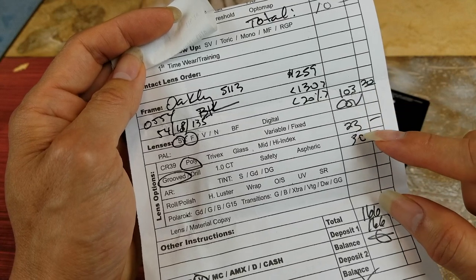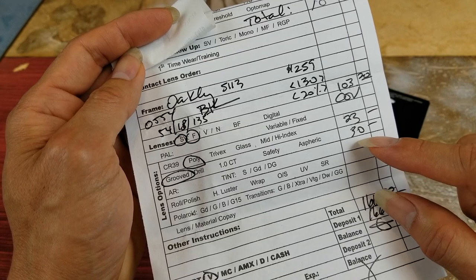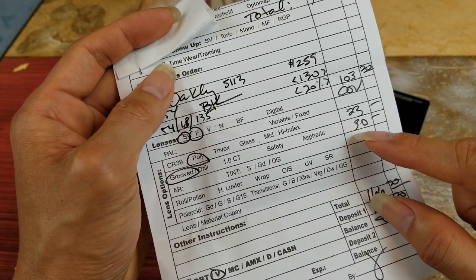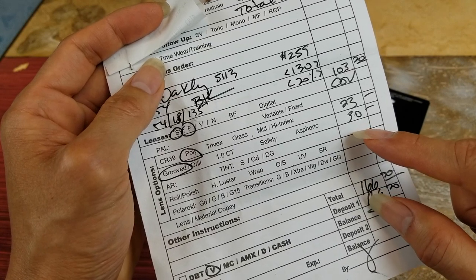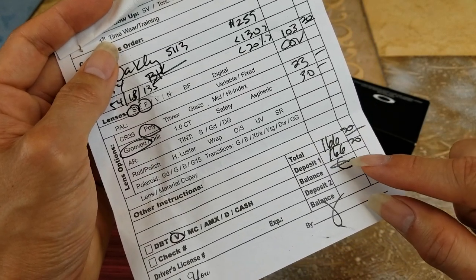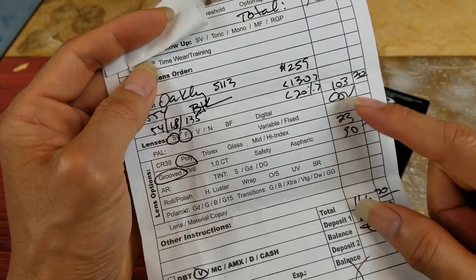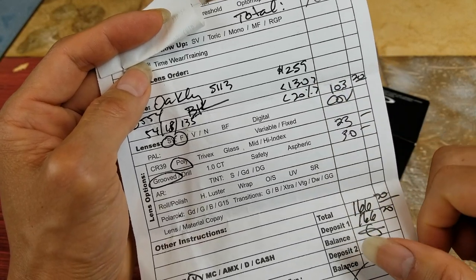There's also $23 for polycarbonate lens, and then $30 because this is a half frame, so they have to use a special plastic or some kind of string to tighten up the lens. So my total damage is $166.20 for this pair — better than paying $259 plus tax. Anyway, let's go ahead and unbox this.